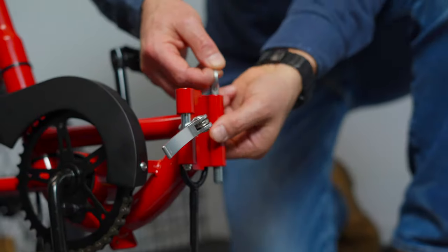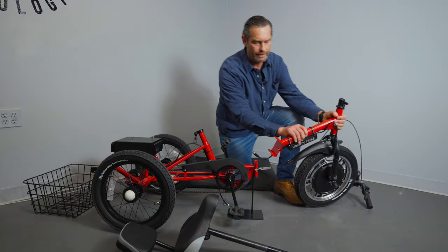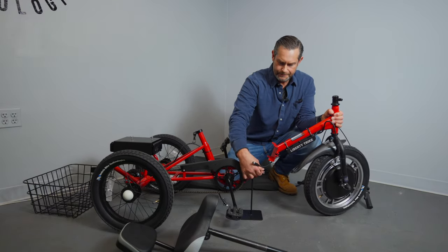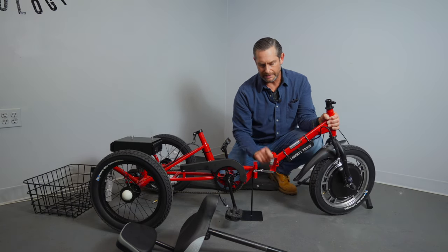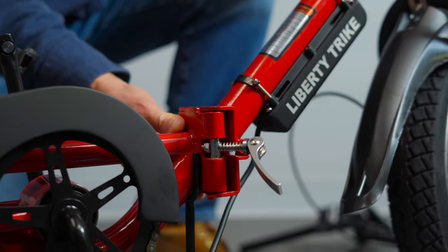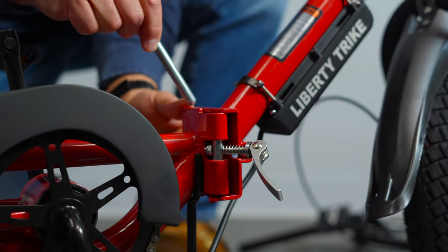You have a clevis pin in here — pull that out of the rear of the frame and set that aside for a second. Go ahead and grab the front half of your Liberty Trike frame. We're going to line up the front half with the rear half, and once I have that lined up, I'm going to take that clevis pin and put that right in the top.